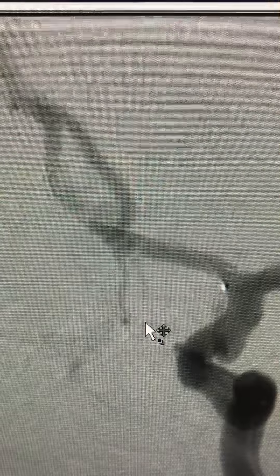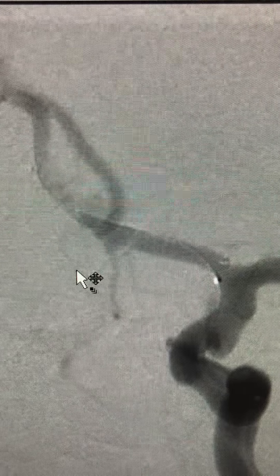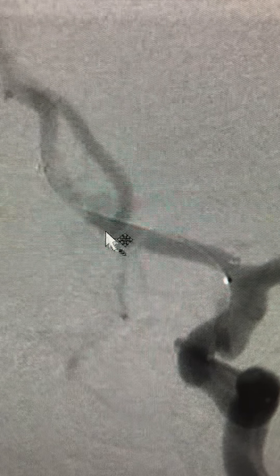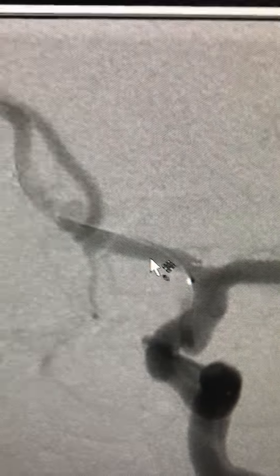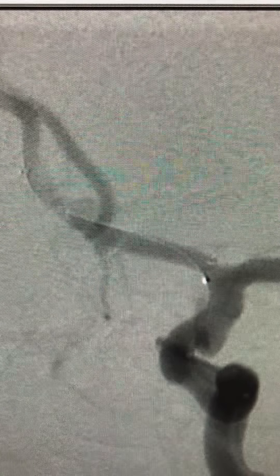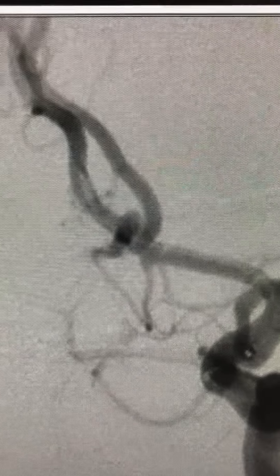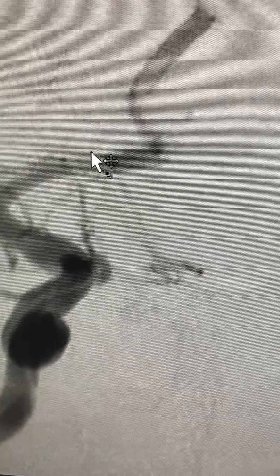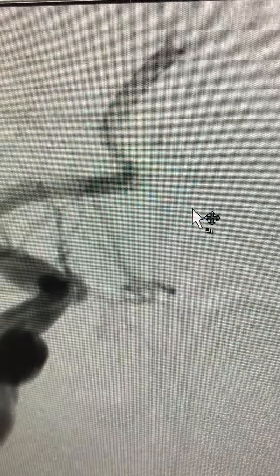So I came from the opposite side — I crossed from the left side and placed a stent across the neck of the aneurysm from A1 on the left side to A2 on the right side. Then I came from the right side again and performed an X-stenting technique, doing the coiling through the X-stent.